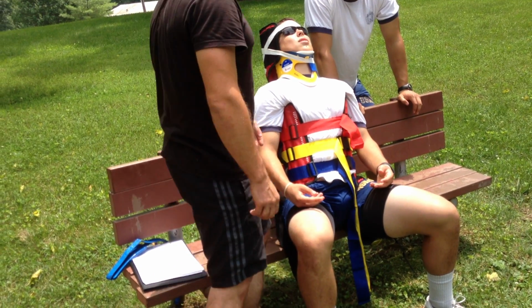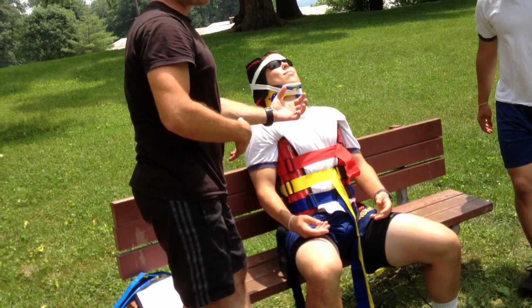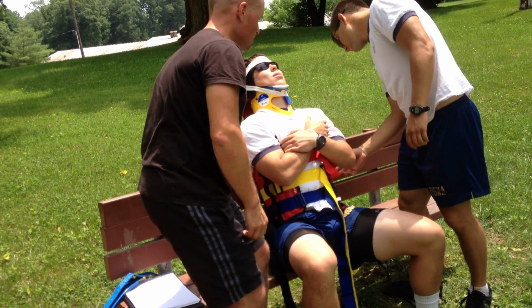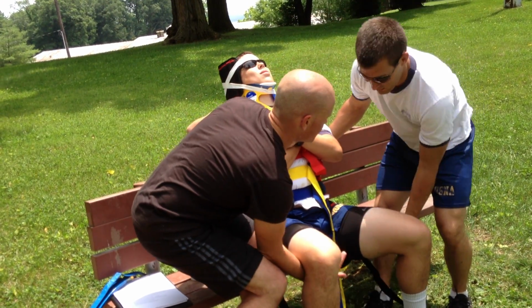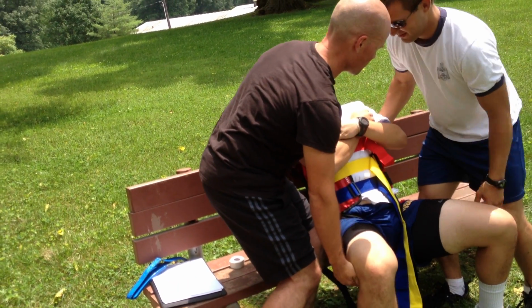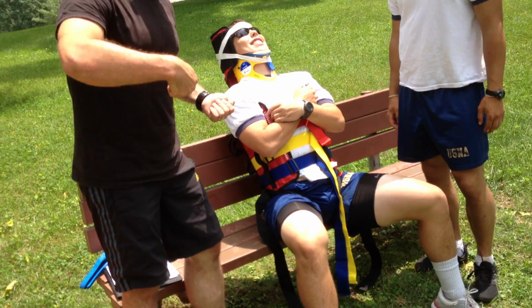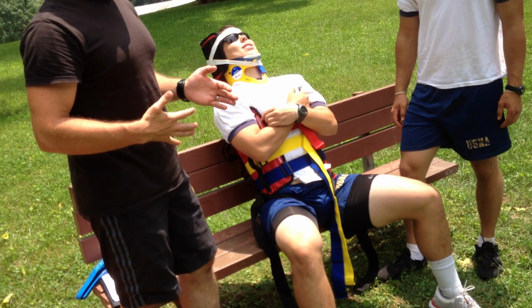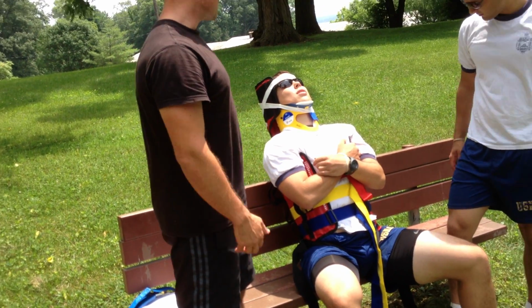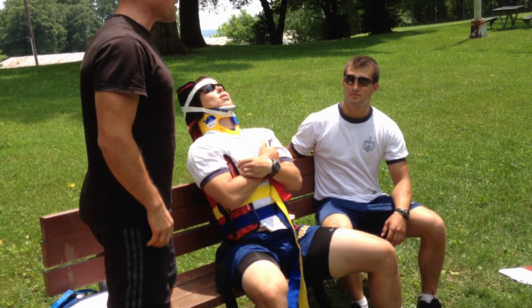Moving the patient, we're going to talk about this a lot, but come around here and this side actually. Moving the patient, depending on the automobile, it ends up just being, sir, give yourself a big hug. Grabbing these handles here, grabbing underneath a leg, and two people can lift the patient and move that patient to backboard. Oh, slide off. Don't fall. All right. Or we could put the backboard on here, rotate the patient and slide them on, but that's for another day. What I'd like to focus on right now is just learning how to put this backboard on. But indeed, for the test, it ends when you say, and I would move my patient onto a long backboard.